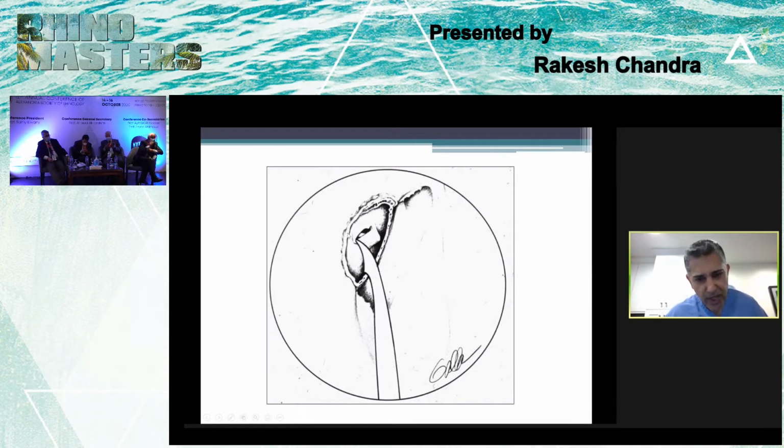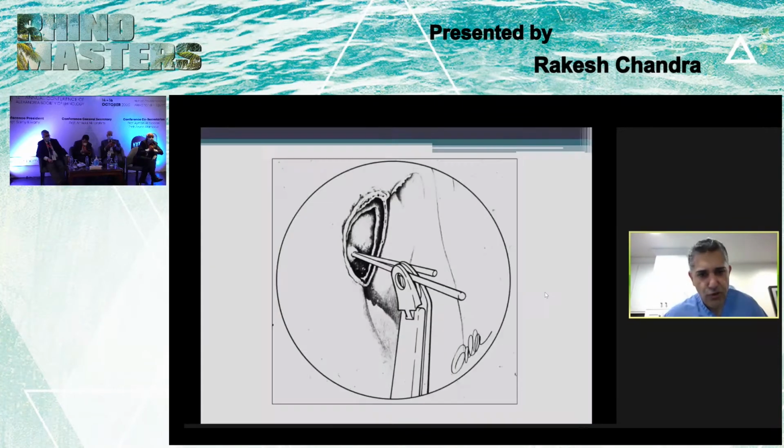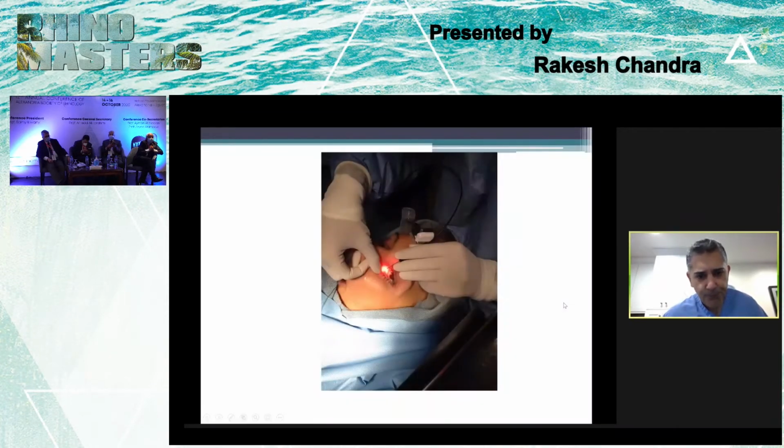It's important, especially in cases where the lacrimal duct obstruction is idiopathic, to sample this tissue. Occasionally we find things like sarcoidosis or Wegener's granulomatosis in that tissue. So that tissue is removed for histopathology. Then these stents are passed through the upper and lower canaliculus and retrieved in the nose, and then secured to one another. These stents stay in there for 3 months.